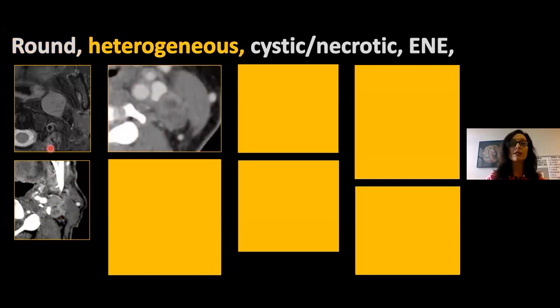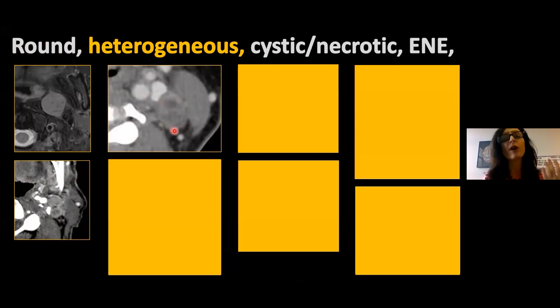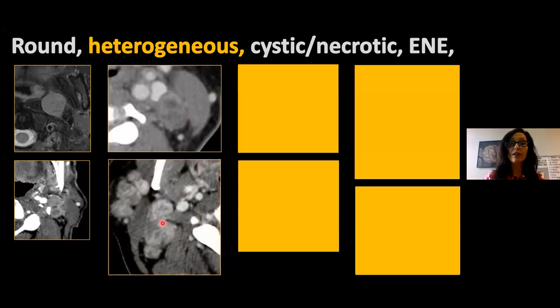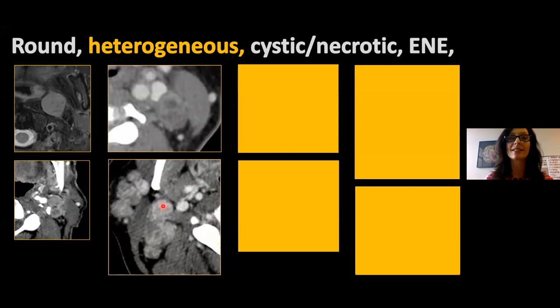What about heterogeneous nodes? Here is a level 2A node with the jugular vein compressed — incredibly heterogeneous and also big. I would have said this is suspicious on size alone, but now I have two criteria: big and super heterogeneous. This is not a fatty hilum — this is a heterogeneous metastatic node. Similarly, multiple clustered nodes together is another feature to look for. When you see how heterogeneous these are internally, they are very concerning for metastatic lymph nodes.